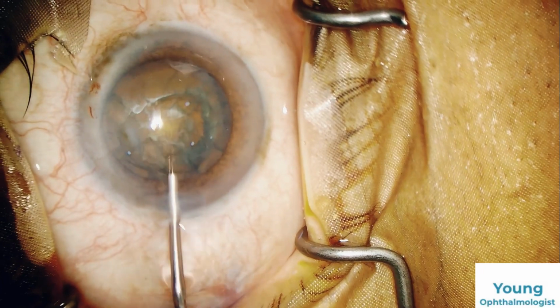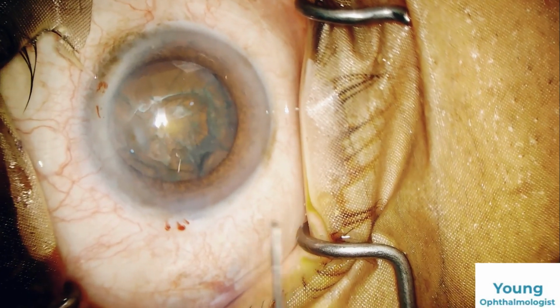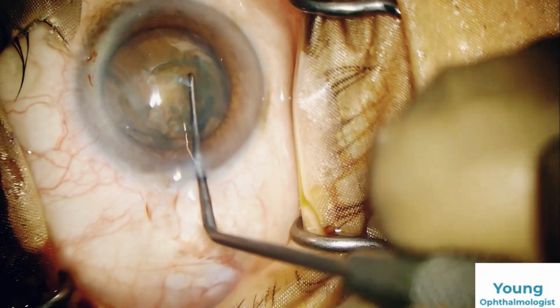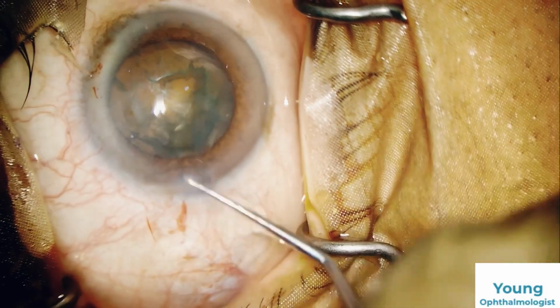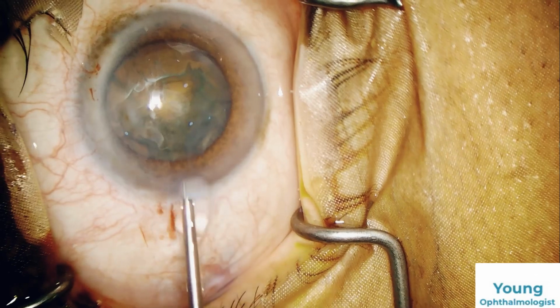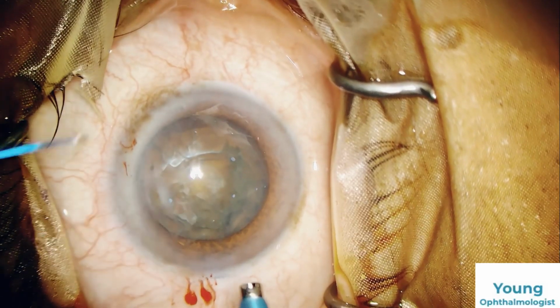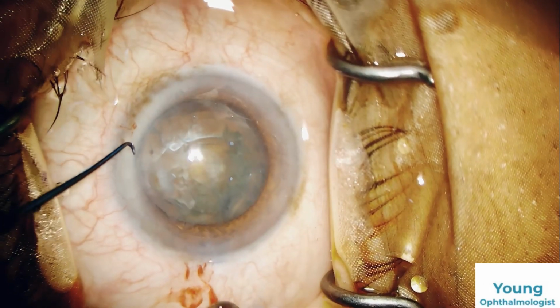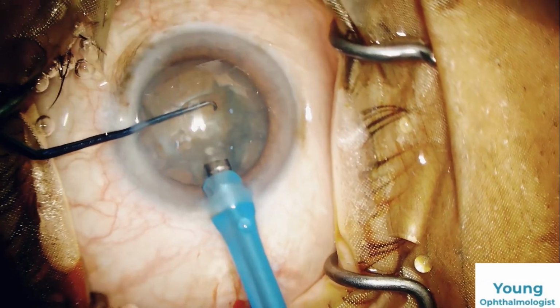Visco is injected again. Now we will check the nuclear rotation with the help of the dialer. As you can see, the nucleus is freely movable now. Pushing some visco. Now it's time to start the phaco. Entering into the eye with phaco 1, we have planned stop and chop in this case.